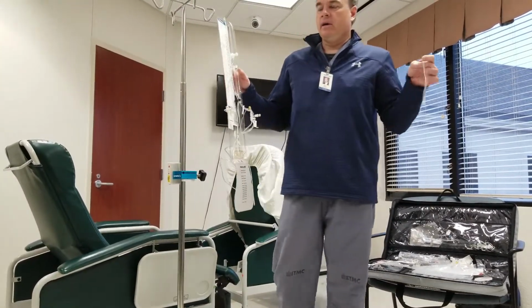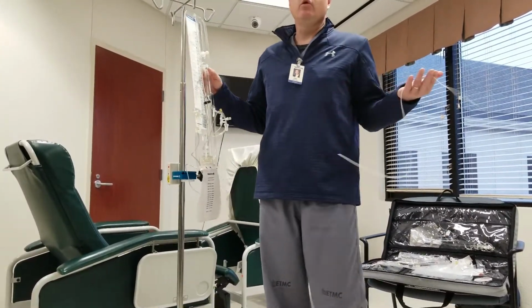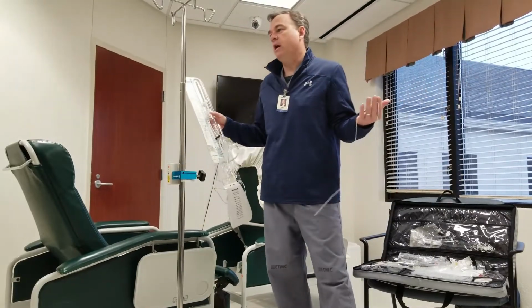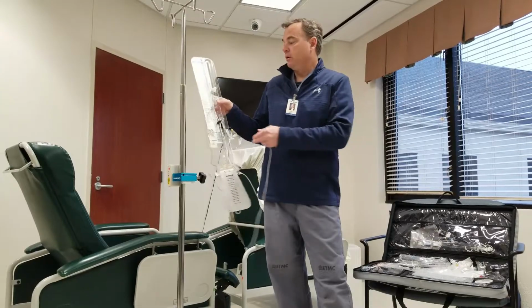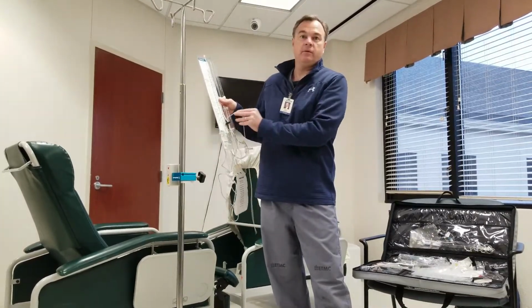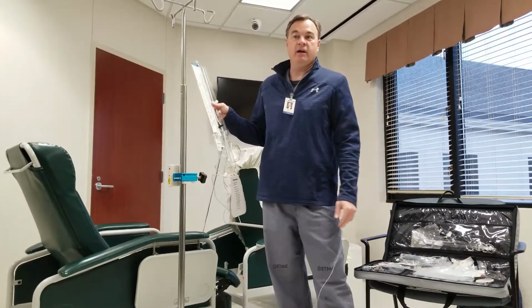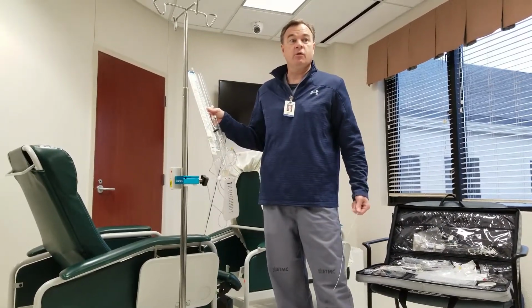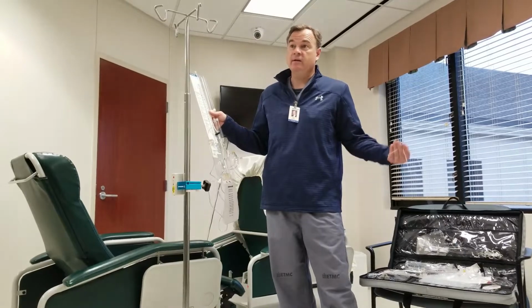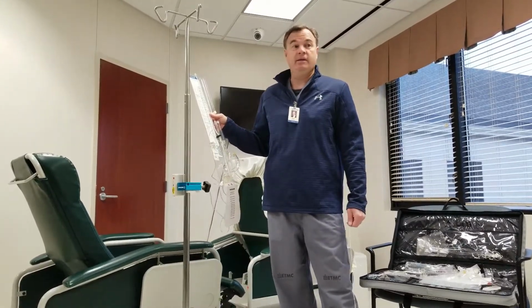So orders get written. Normal ICP, every one of us in here has about 120 millimeters of pressure. That's water. So that's basically the pressure that you have on it every day. When you sneeze, it elevates. When you stand up, sometimes it elevates. But in general, 120. So typically what you see, like in Dr. Pelosa's case, he wrote it for 8.